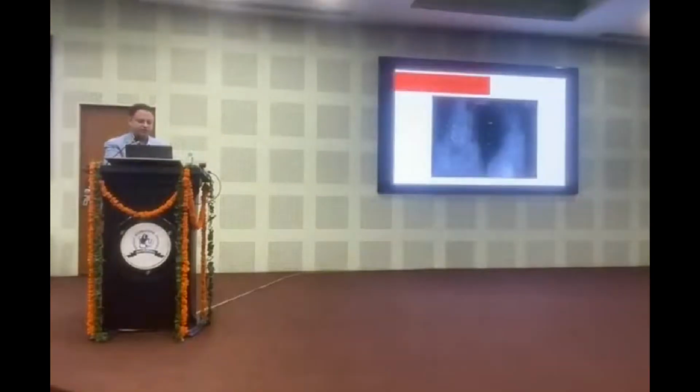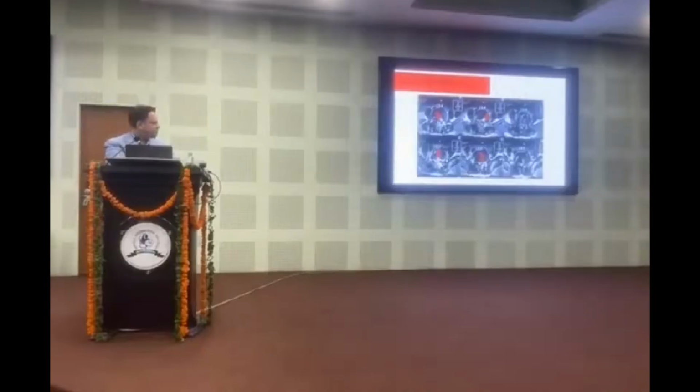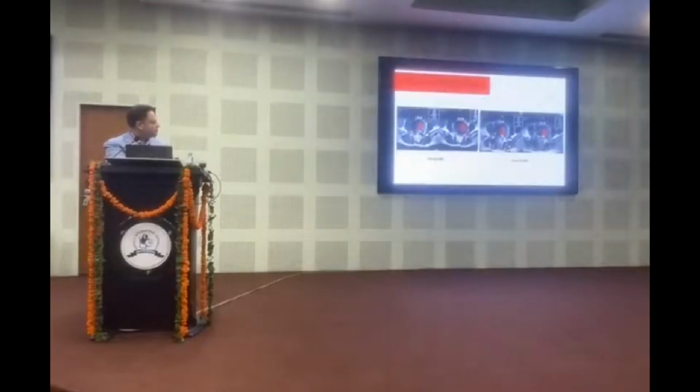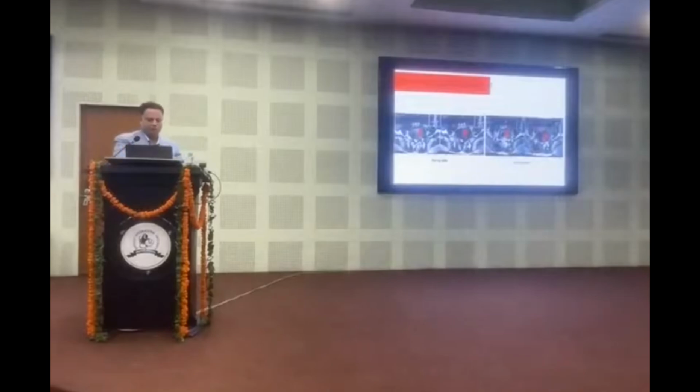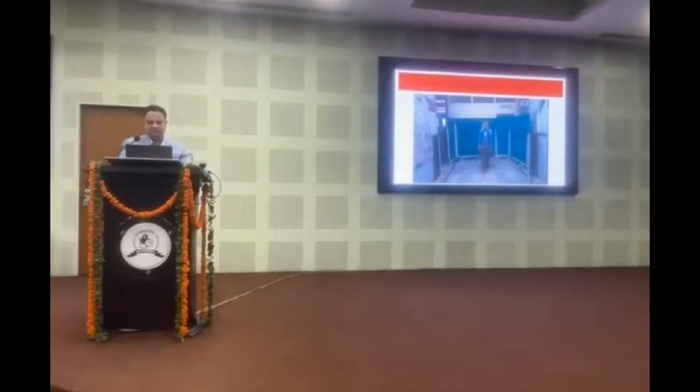These are the intraoperative images. Final post-operative radiograph. This is the post-operative MRI. You can notice the decompression is there. You can see this was every other level before, and this is the post-op. So before, L5 again, pre-operative and post-operative. These are the post-operative scars and the patient mobilized.